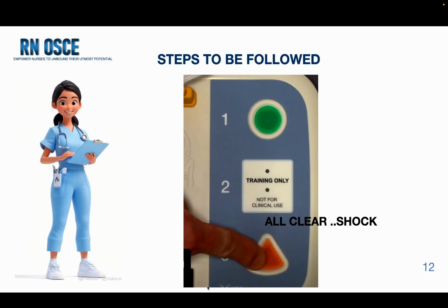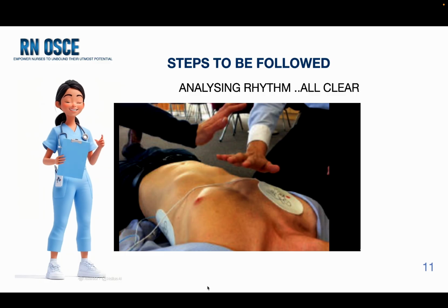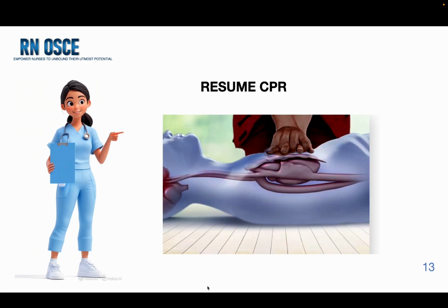Analyzing heart rhythm. Do not touch the patient. Shock advised. Charging. Stay clear of the patient. Deliver shock now. Press the orange button now. All clear, delivering shock in 3, 2, 1. Deliver shock now. Shock delivered. Start CPR.